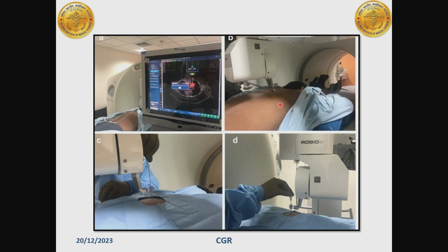Under aseptic conditions, the biopsy is planned, that is the draping is done with povidone iodine and alcohol, and then the coaxial needle is placed in the clamp or the needle holder of this robotic arm. Once this needle is in position, the local anesthesia is administered as deep as the muscular layer. Once the anesthesia effect is evident, we introduce this needle inside the patient's body.